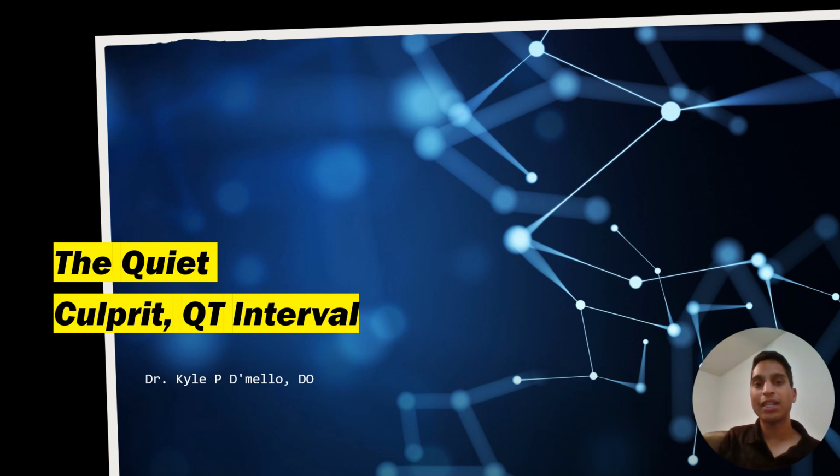I'm finishing my EMS block up and wanted to give you guys a presentation on something that I think is pretty important, the QT interval. I think when looking at EKGs, it's something that we forget a lot to look at, and we don't realize all the implications that it can have. Hence why I call this the quiet culprit.